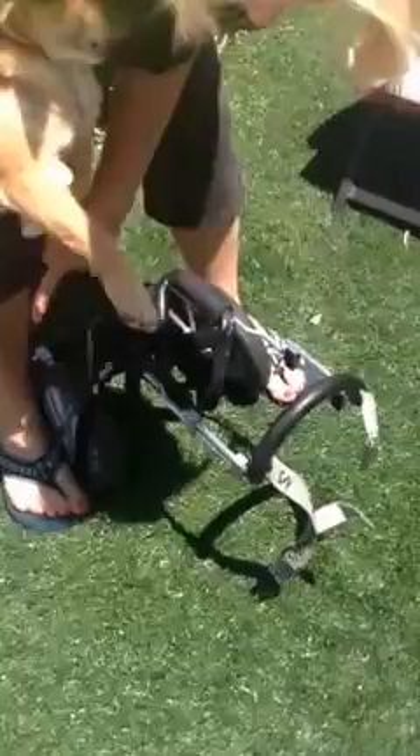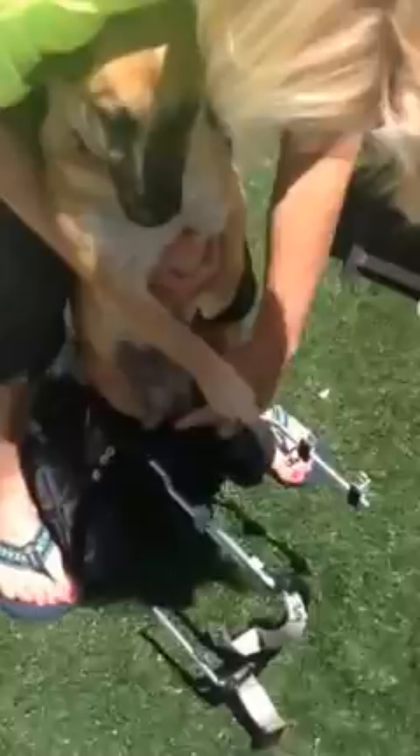Put the cart like this, put both straps out to the side so they're not in the way. Hold it with your feet so he doesn't take off.